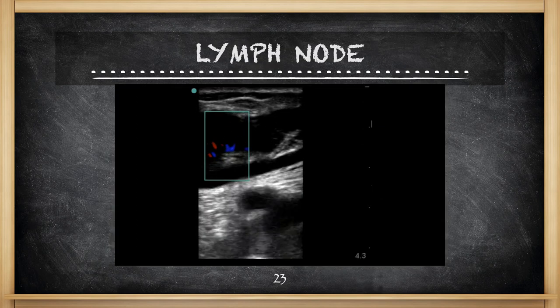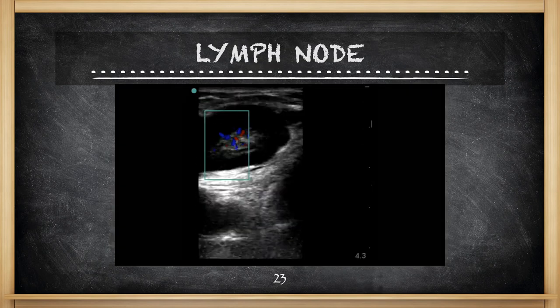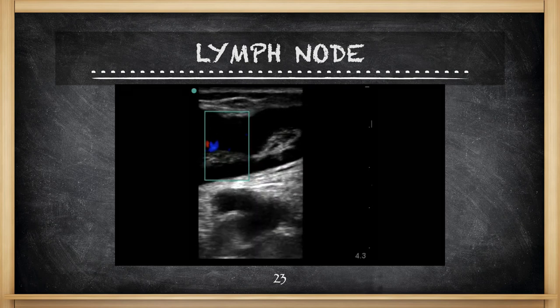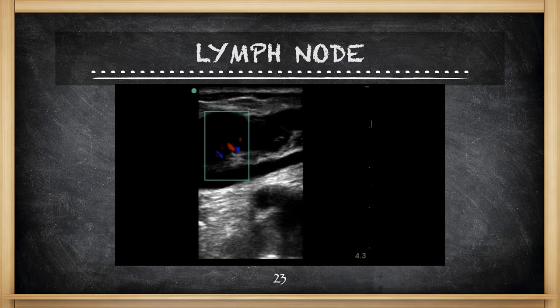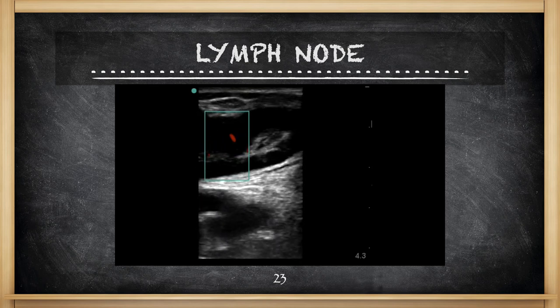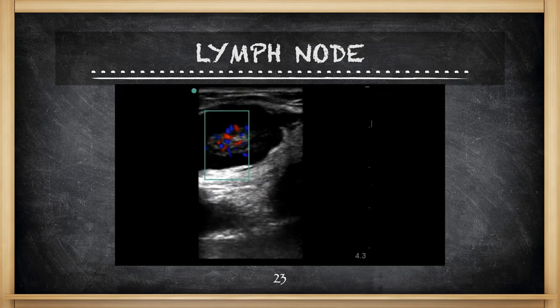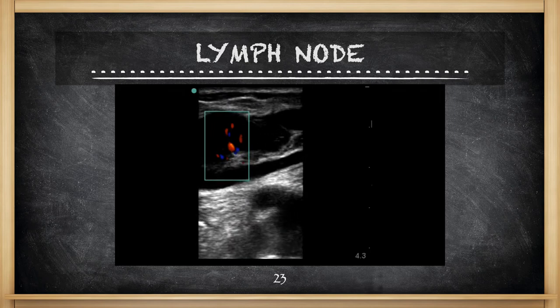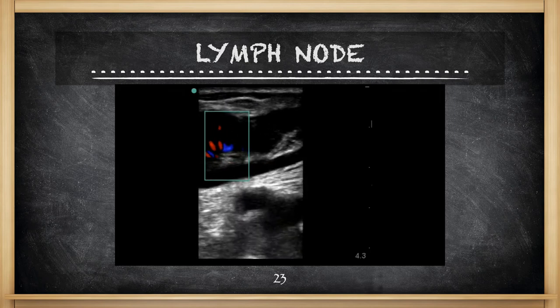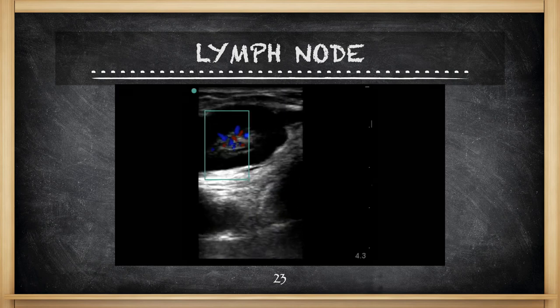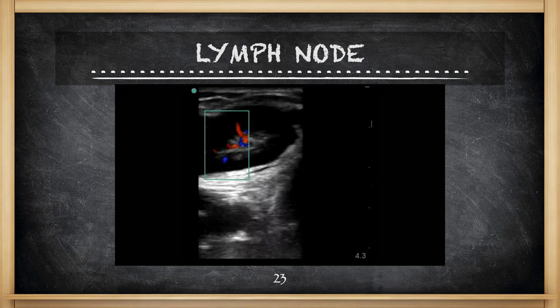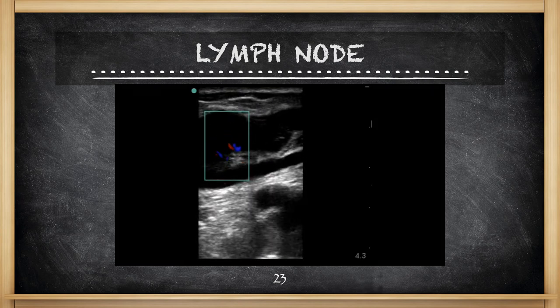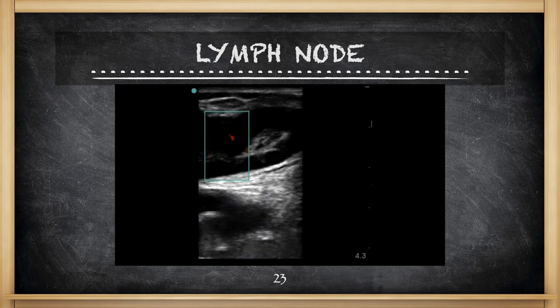Sometimes there are structures you will encounter as you go down the leg which may appear as an echogenic focus and make you think you have a blood clot. This is actually a lymph node, and in patients coming in with lower extremity swelling complaints, they might have swollen lymph nodes. The way to tell the difference is to put color flow over the structure — if you see branching in the center that looks like a micro kidney, that is more suggestive of a lymph node. Also, a lymph node will appear and disappear and will not be continuous all the way down the leg.